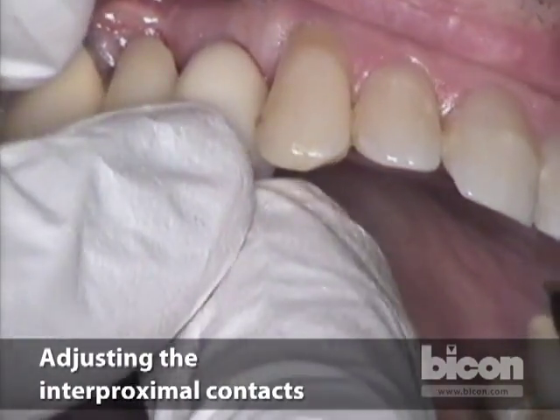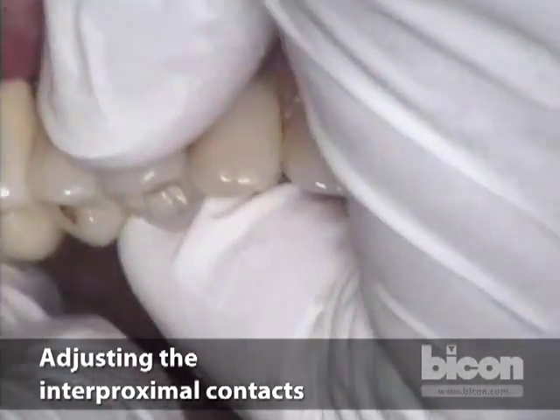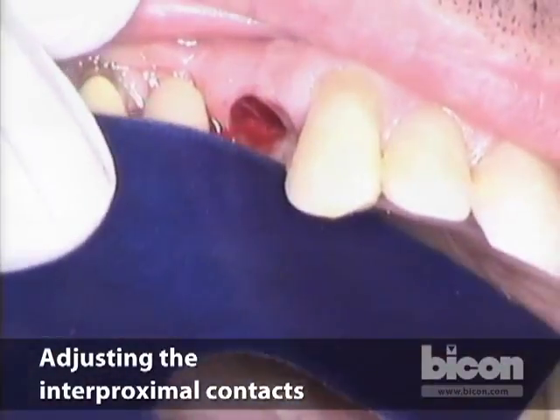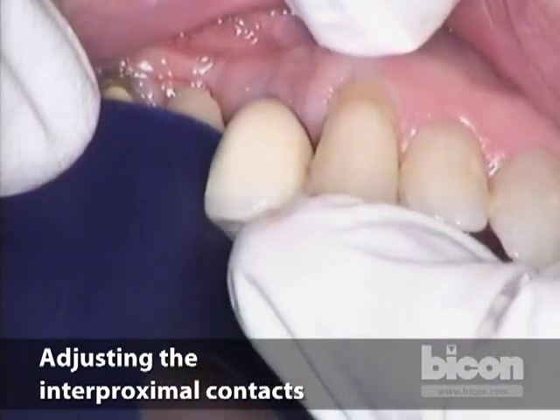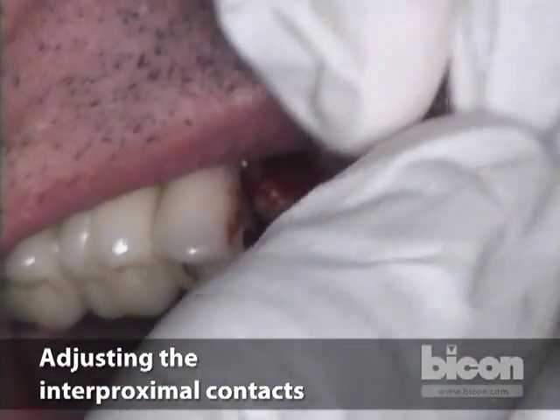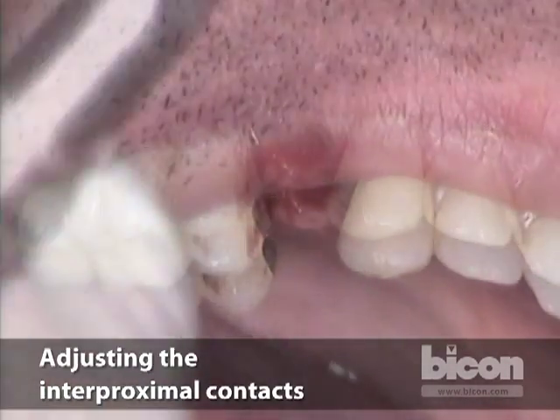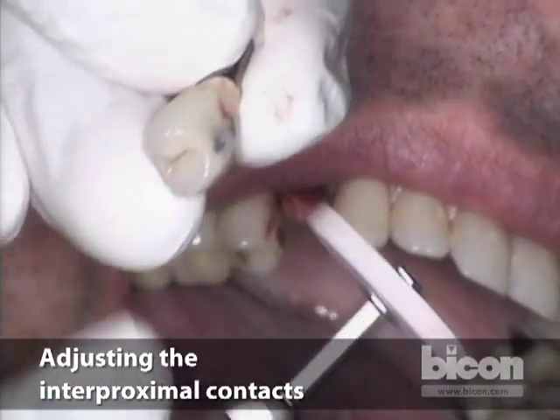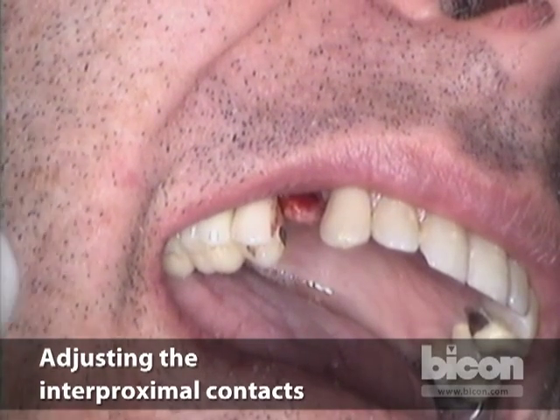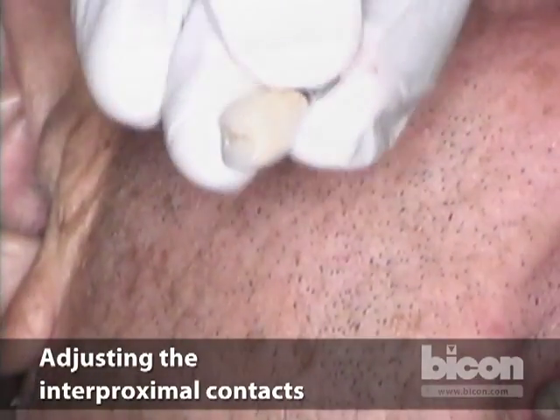I'd like to show you how you would adjust interproximal contacts. Let's say the distal contact was too tight. My preference is to grab the crown, remove it, then place an articulating paper between the surface and slide the crown down. Remove the articulating paper — that will leave a mark that you can then adjust with a silicone wheel. Then you can insert it again.